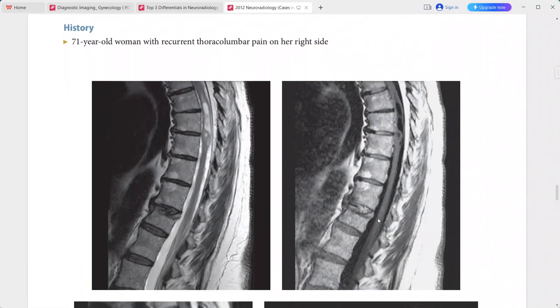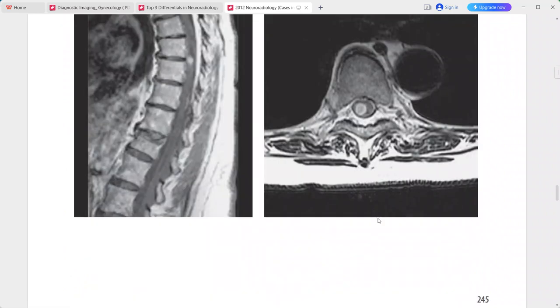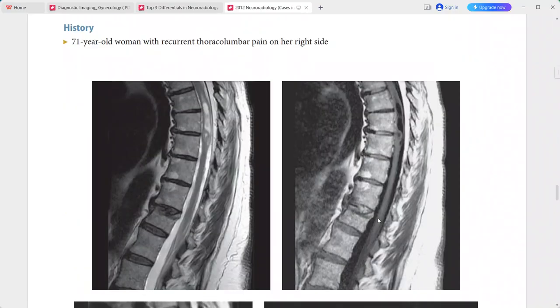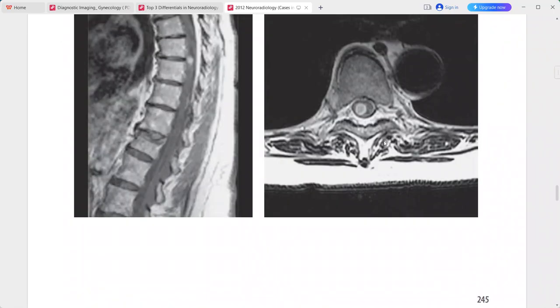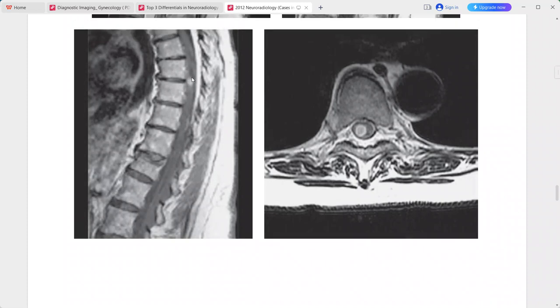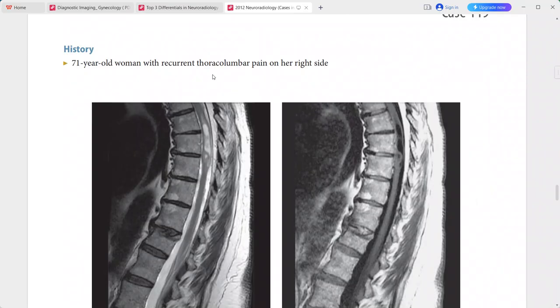Next is a case of a 71-year-old woman with recurrent thoracolumbar pain on her right side. There is a well-circumscribed cystic and solid intramedullary mass in the lower thoracic spine. The solid nodule within this lesion is enhancing homogeneously on post-contrast sequences, both sagittal and axial.